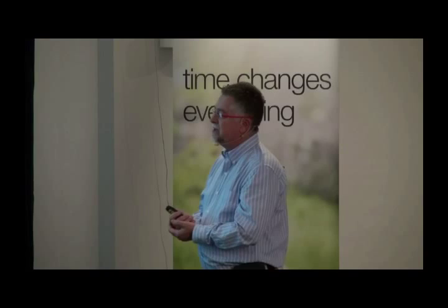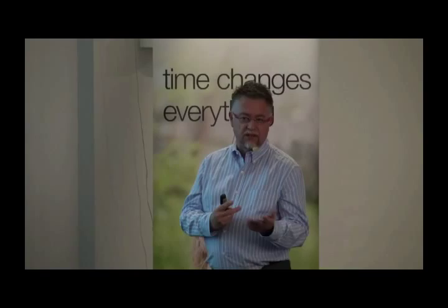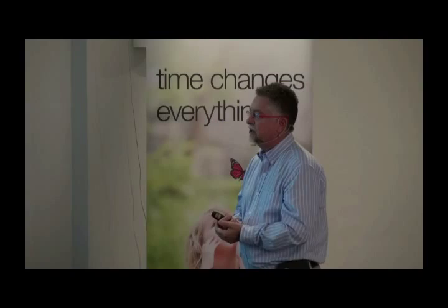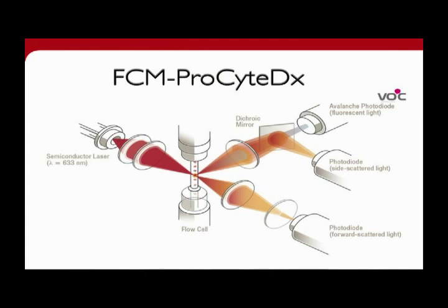They are really good machines that were designed for industrial use to count particles in oil and things like that. They're basically kind of like this little dude, right? Here's a red bead, here's a green bead, and so on. So they do a fairly decent job. They're quick, inexpensive, and easy to maintain. But as you will see, the technology is nothing compared to what a flow cytometer will do for you.